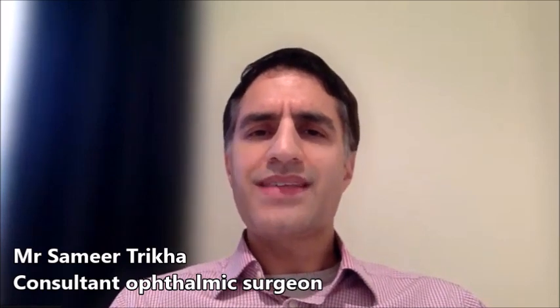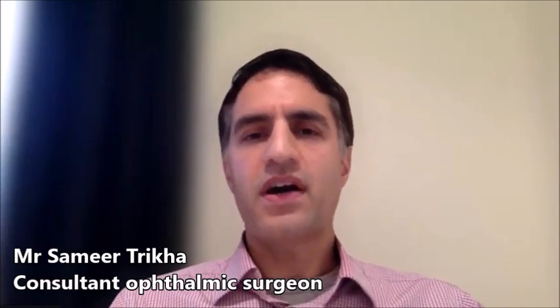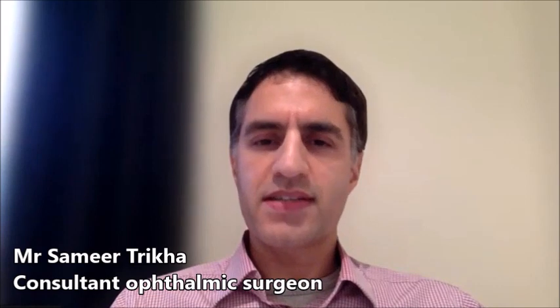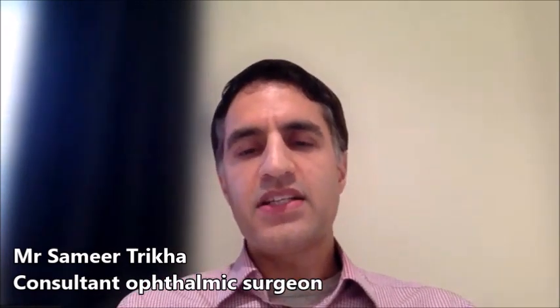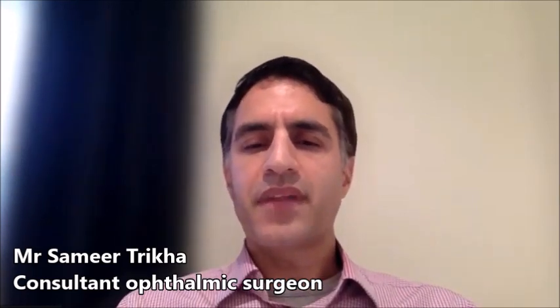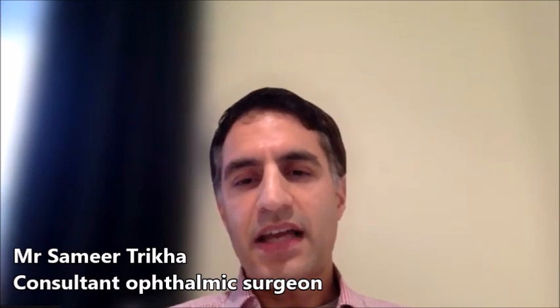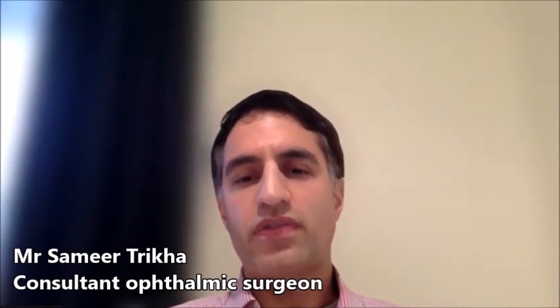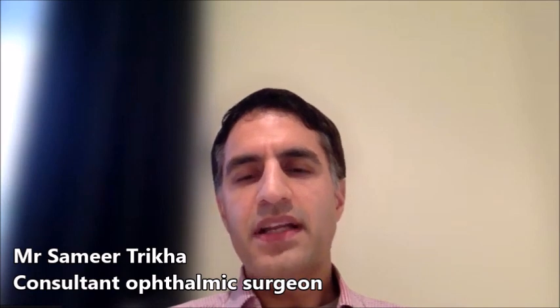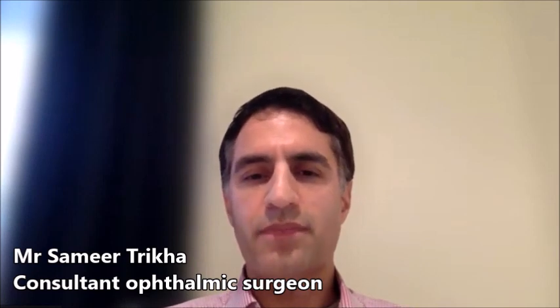However, it's worthwhile mentioning that certain types of lenses may not be the most appropriate for individuals based upon previous eye conditions. For example, patients who might have glaucoma tend to suffer from something called low contrast sensitivity. And that's where the ability to differentiate types of colors, like shades of gray or red or blue or black, is slightly impaired. Now, in the third group, the multifocal group, what can happen is your contrast sensitivity is impaired slightly anyway because of the nature of the lens. And so I don't tend to recommend the multifocal lens group in patients with glaucoma. Similarly, I don't tend to recommend this type of lens in patients with macular degeneration, where the central macula may be affected as well.